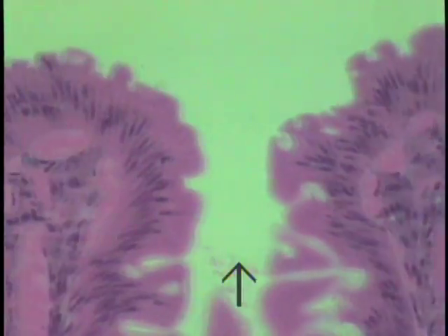Now, as one courses to different villi, and we examine the very same features, it's just to illustrate that it wasn't just an arbitrary villus that showed this feature. They all will show it if it's cut in section. So you can see this group of intestinal epithelial cells, all of them are sitting and have direct access to the capillary network, this vast vascular network that forms within the lamina propria and is within the core of these villi. This is cut a little bit obliquely, so we really can't see it. We're not getting into a true section of it.